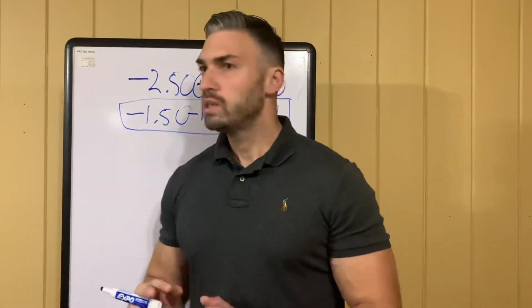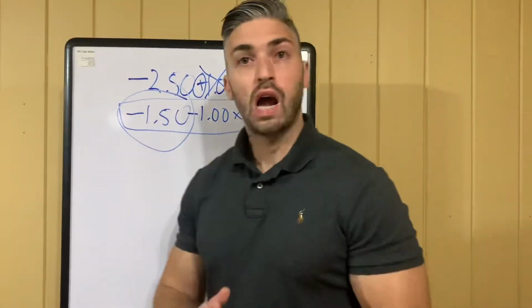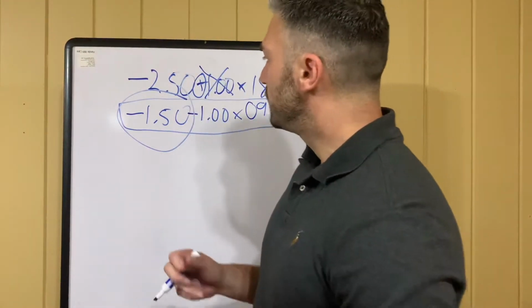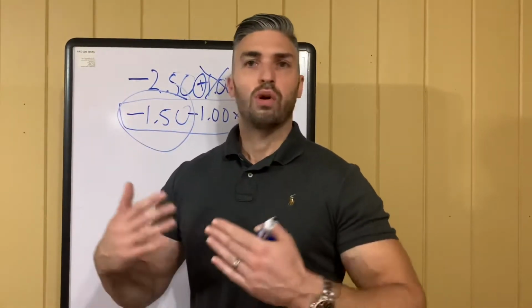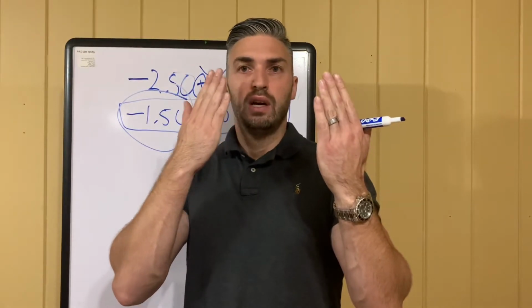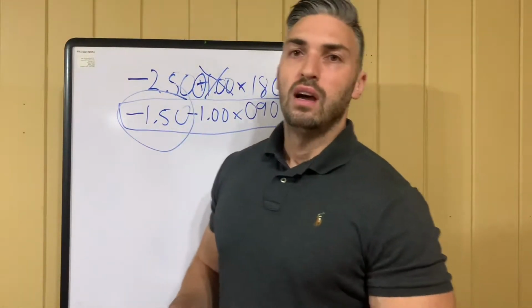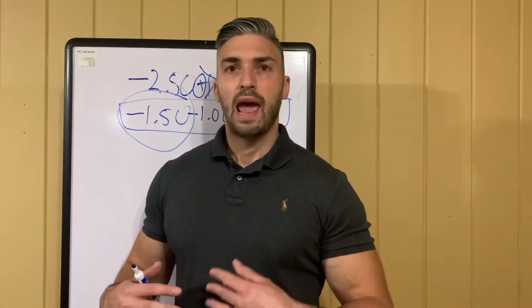The next thing that's really important is to know that if your sphere power is 4 diopters or greater, we have to consider vertex distance. Vertex distance is the refractive distance, which would be the phoropter or a pair of glasses sitting off of the eye, the distance between the front of your cornea to the back of that eyeglass lens or the back of that phoropter. So we have to consider that with contact lenses. A contact lens will always be fit more plus than an eyeglass prescription.